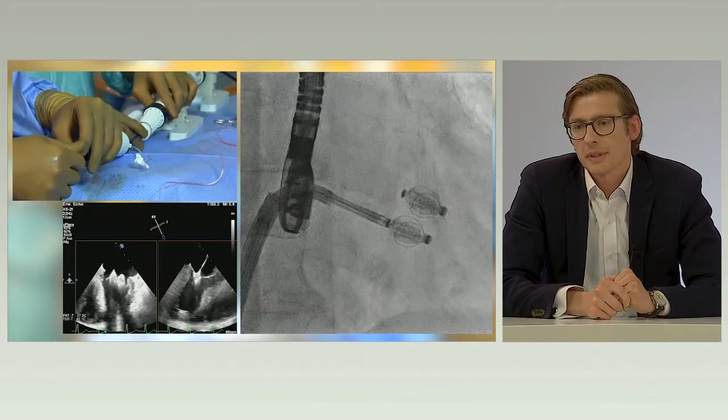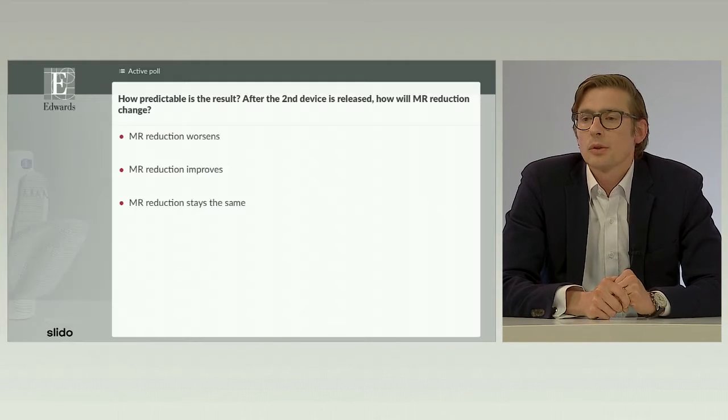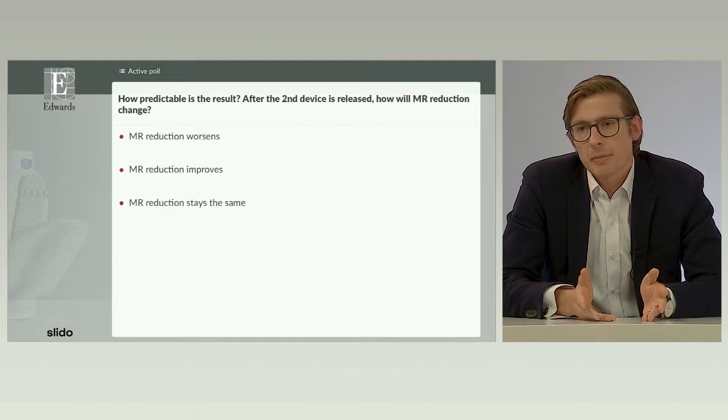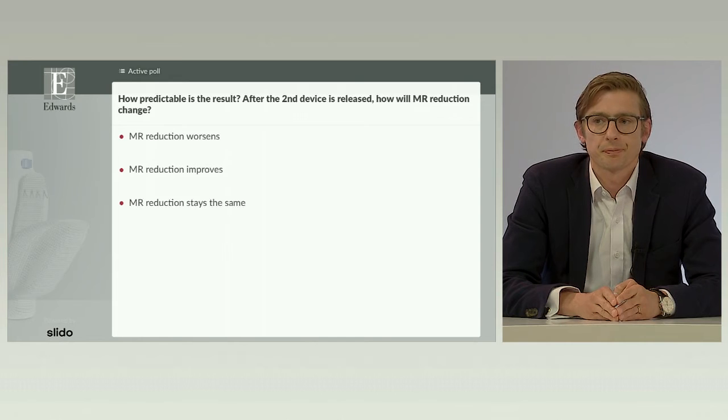And here comes the second and last poll question for this case. So in general, what do you expect? When you compare the MR result before and after release, what would you expect happens after release? MR gets worse, MR gets better, or actually stays normally the same?